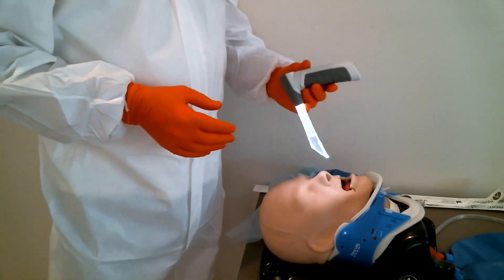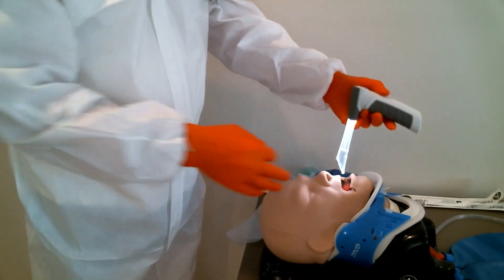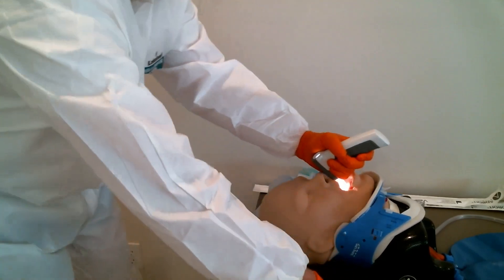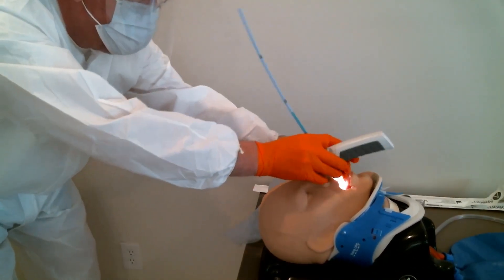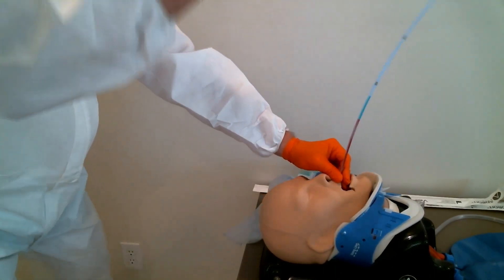So for this intubation, I'm going to use the V-scope coming in midline: tongue, epiglottis, notch. I'm staying a very safe distance away and I'm quickly passing the bougie through the vocal cords.